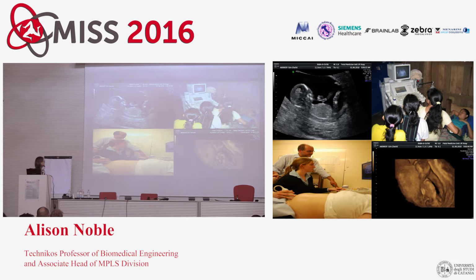Okay, so that's really just the warm-up to what I wanted to talk about. What I really wanted to talk about was the work we've been doing recently, probably over the last 6 years or so, in the area of fetal ultrasound. As I said right at the beginning, it's motivated by what I call Western world problems. In the Western world, women generally come for a first scan at 12 to 14 weeks to date the pregnancy, and then if there's any risk, they are monitored from then onwards.